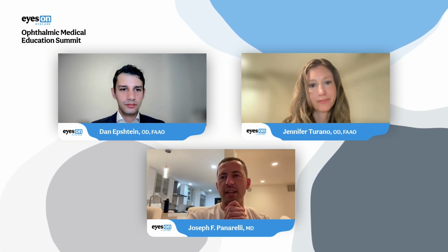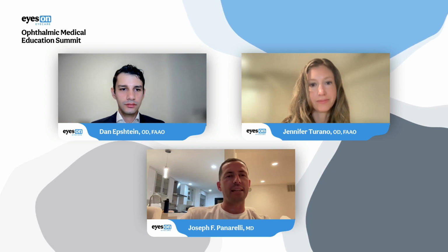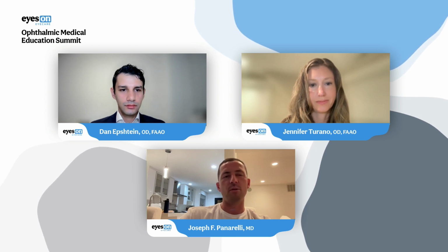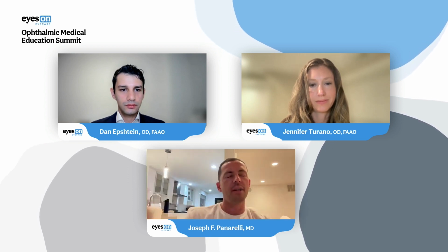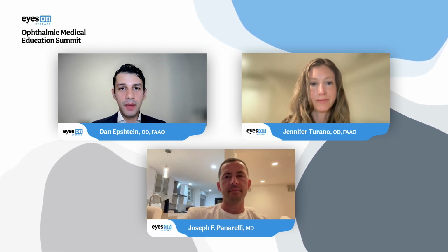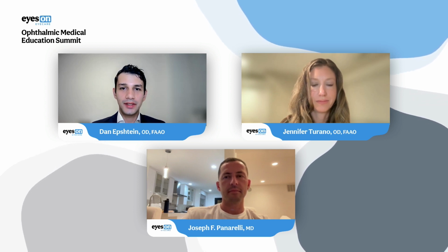We have a question that has come in about OCT angiography and how we use that in some of our complex patients. Maybe I'll start with Dan and get your insights on where OCT angiography fits into your diagnostic algorithm. So I think OCT angiography is a very powerful imaging modality, but I don't really use it too much for glaucoma. I really reserve it for my retina cases.